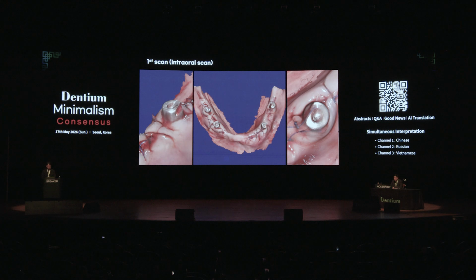After scanning, we matched the implant library to the scan data in the CAD program. This allowed us to reproduce the three-dimensional position of the fixture. Some intraoral scanners can also use AI to recognize and match the scan body automatically during the scanning.